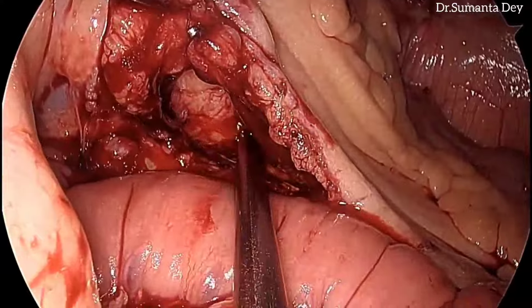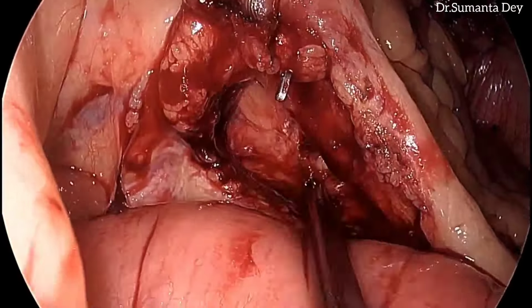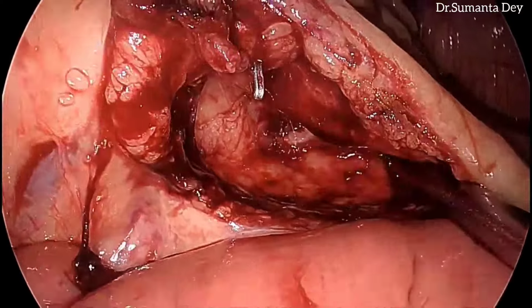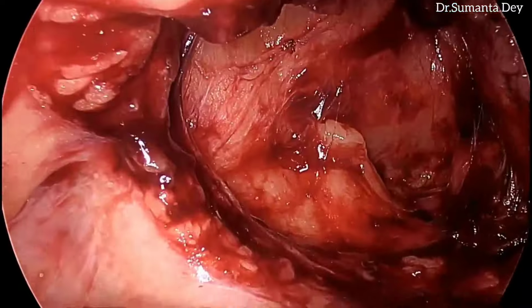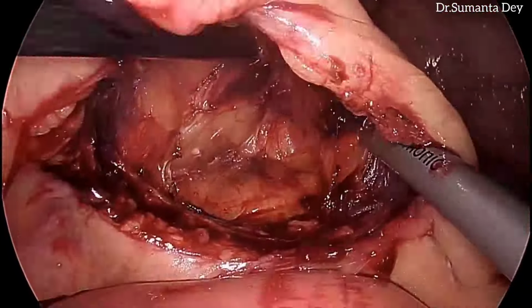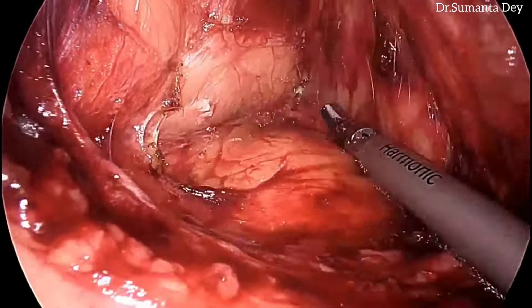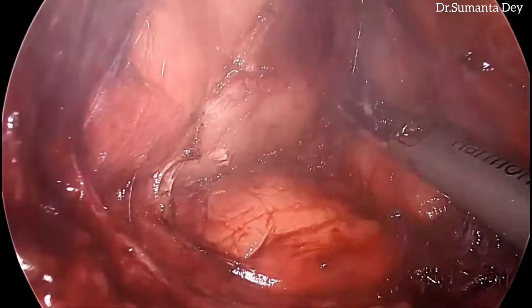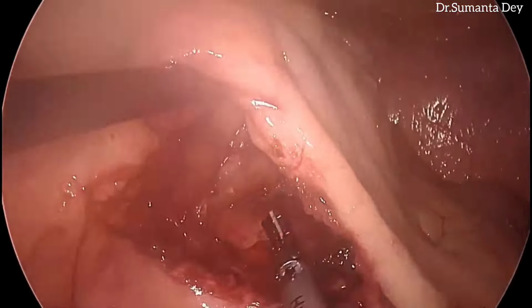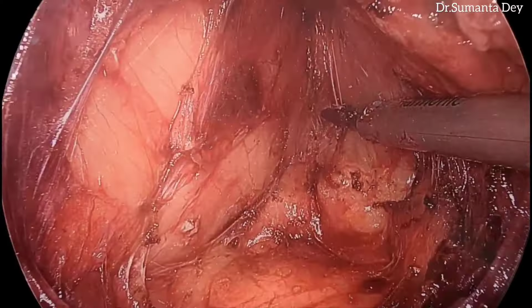So it was some arterial branches, maybe branches of the artery of Moskowitz. I dissected and ligated it and sucked out the blood that had spilled, because in this early phase of dissection, if the field gets blurred with blood, it will be very difficult to identify the plane. So it is important to have a clear vision of the area of dissection, particularly in this retrocolic window. Following this window and the same plane, we proceeded forwards with medial to lateral dissection, which we usually do in laparoscopic complete mesocolic excision.